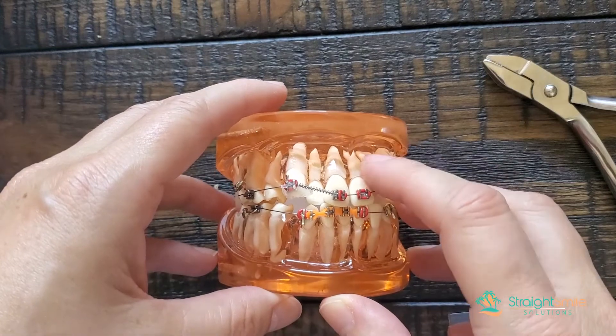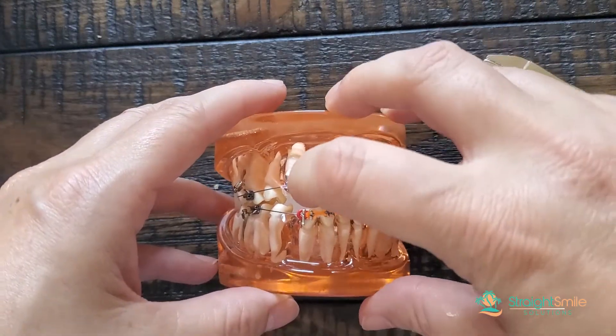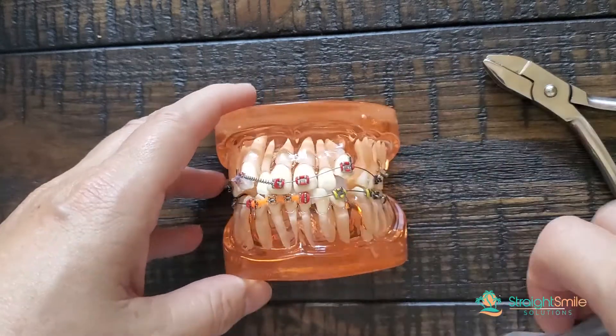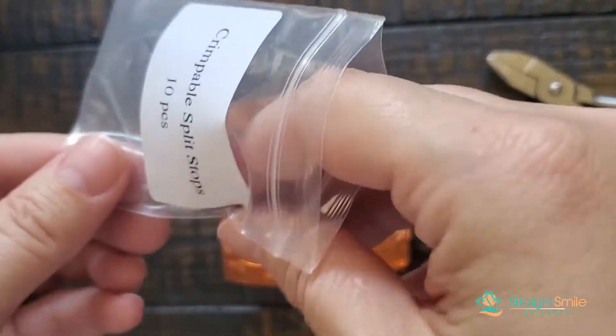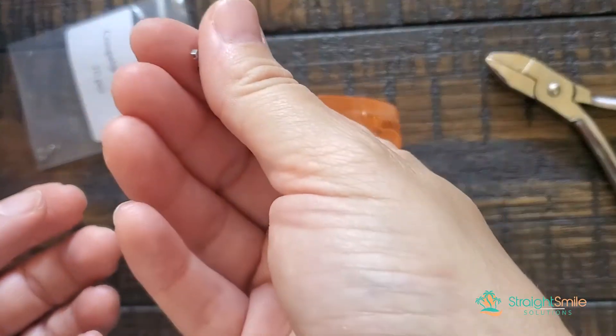Crimpable stops are a fantastic hack. Keep in mind, they don't always stay on. So if you don't want to completely untie the patient or take the wire out, I just slide it, put it on and squeeze it. You can order these — they come in a variety of different gauges, so you've got to think about how you're going to be using it and what type of wires you're going to use. These are teeny tiny — see how small they are?